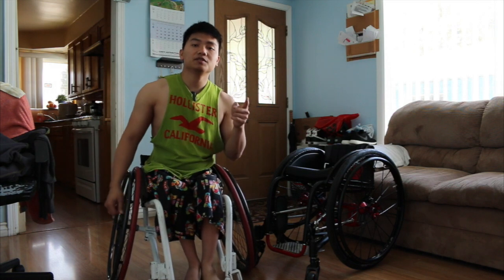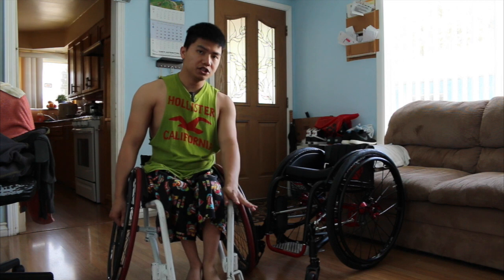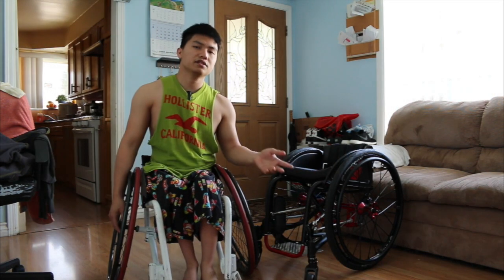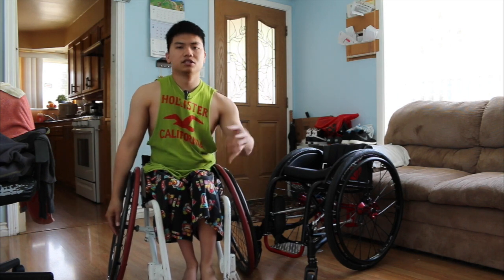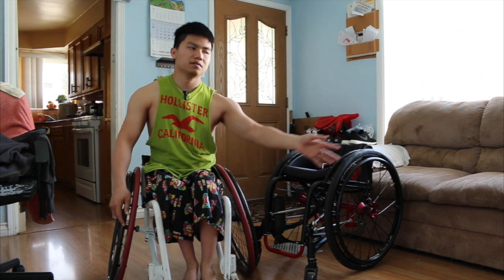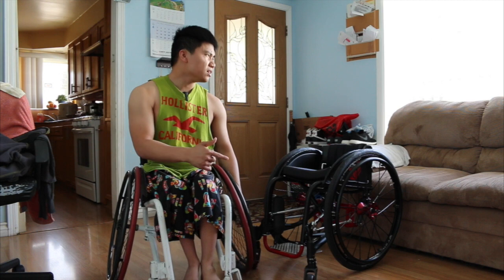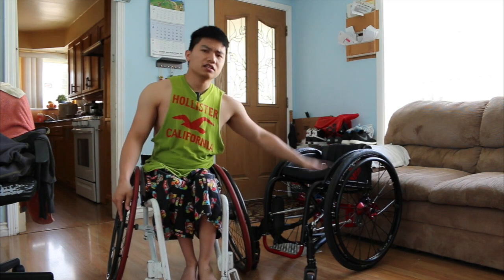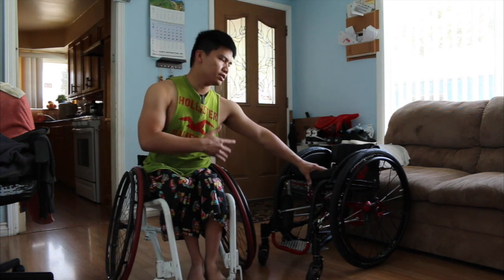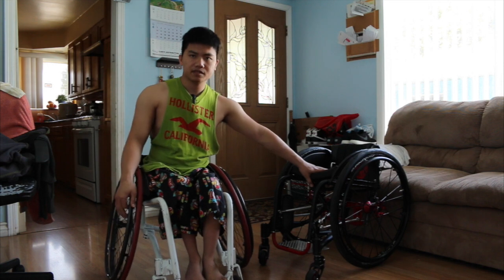Hey, what's up guys. Today's video I'm just gonna show you guys how I transfer from my wheelchair to another wheelchair. I've been doing transfer videos for a long time, but those were transfers from wheelchair to the couch, and from the floor to the wheelchair and wheelchair to the floor. But today, since I got the new wheelchair, I'm just gonna show you guys how I transfer between both of them.